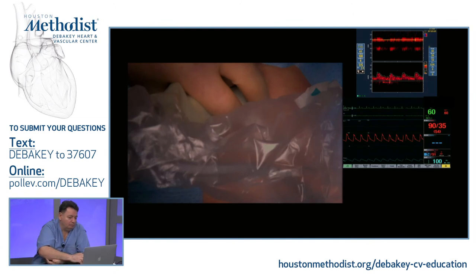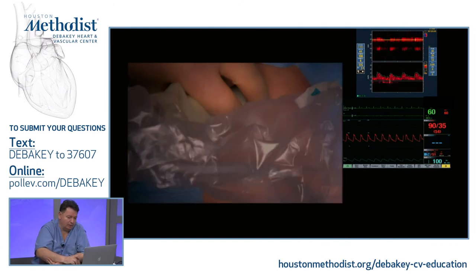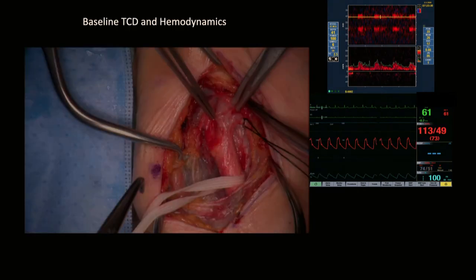Okay, so the setup that we have in the operating room is as follows. Well, first of all, we do the job in the OR that these guys won't do for me up in the vascular lab, and that is actually determine what level the bifurcation is, because that's fundamentally important to me in where I make the incision and the type of incision that we're going to utilize. Okay, so we figured it out because we always target the incision. We go right down on top of the carotid bifurcation.